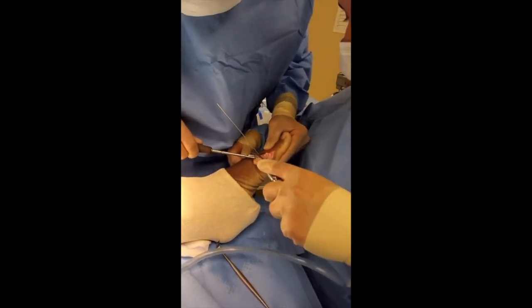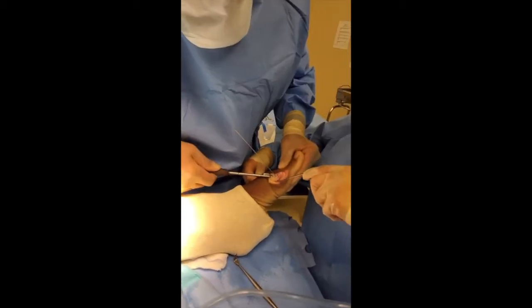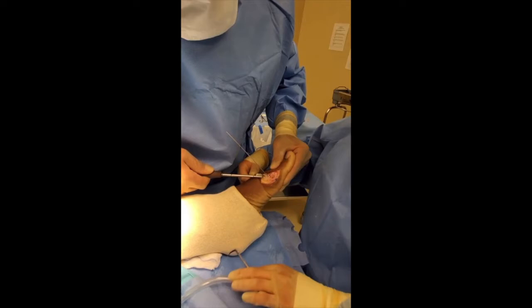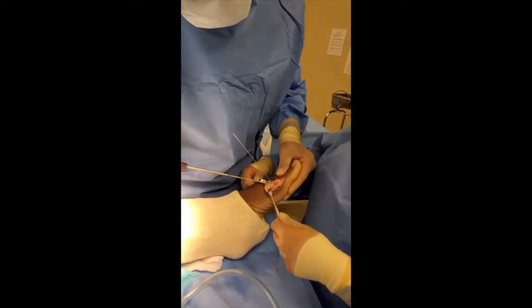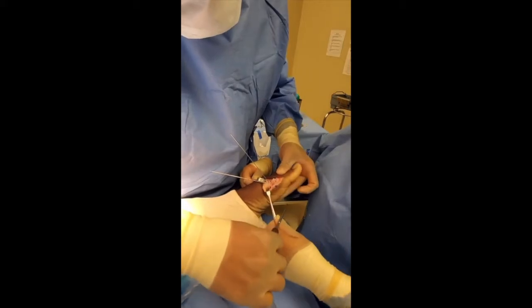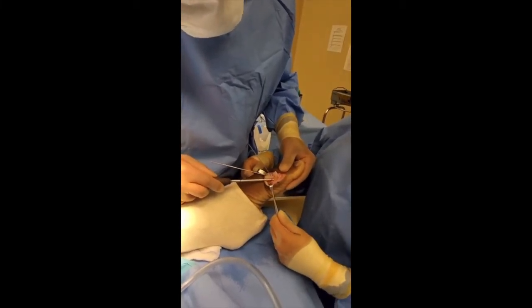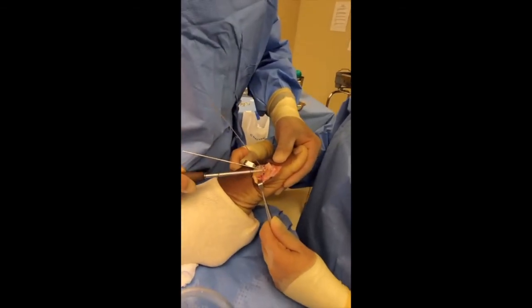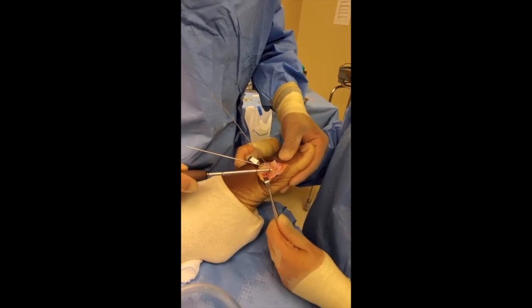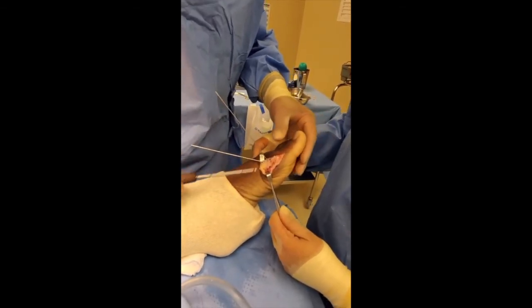The incredible thing is there's so much torque on this screw that I think he could get up and run on his foot for a quarter mile and nothing would happen to it — that's how strong and stable this is. When he steps down, pressure coming up actually impacts the fracture site, making it even more stable. This V-cut prevents it from sliding down, and this part prevents it from sliding up — it's highly stable based on the geometry of the bone cuts.